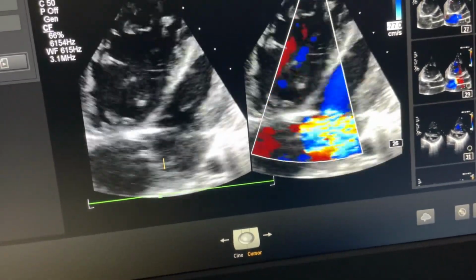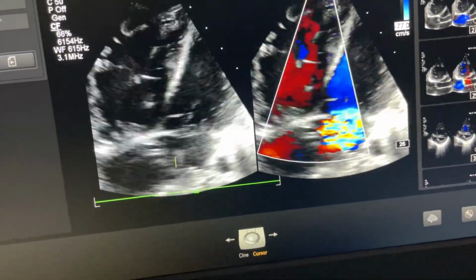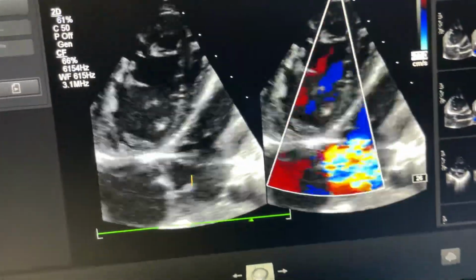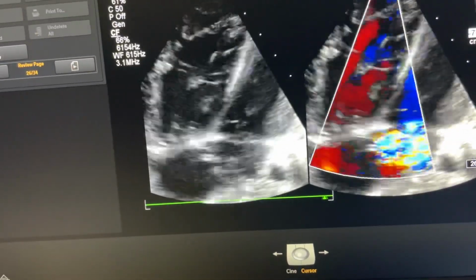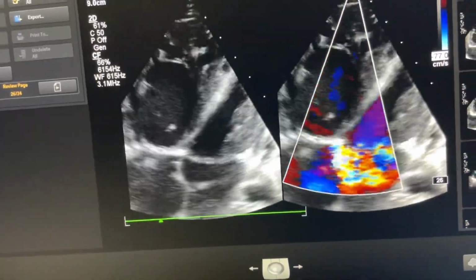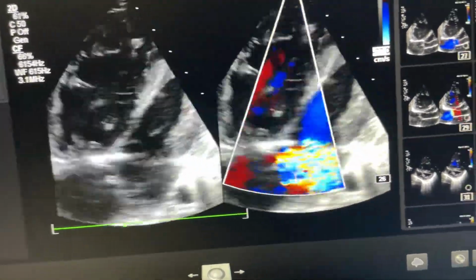Here the perforation is the communication between proximal and distal LA chamber, and that is very much obstructed flow. You see the very much obstructed flow. That is why pulmonary venous, pulmonary arterial hypertension, and right atrium, right ventricle severe enlargement has happened in this case.